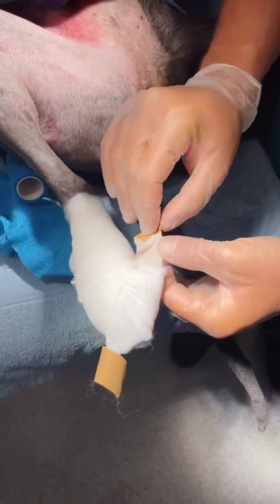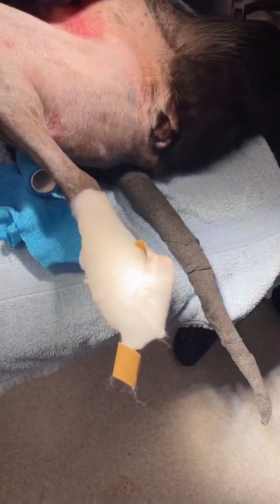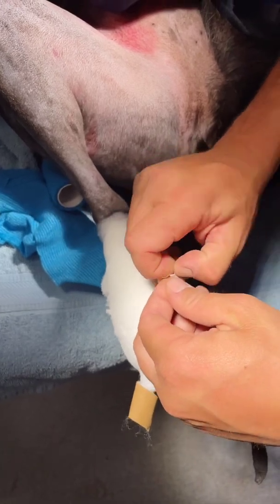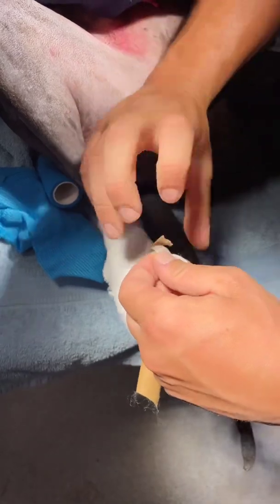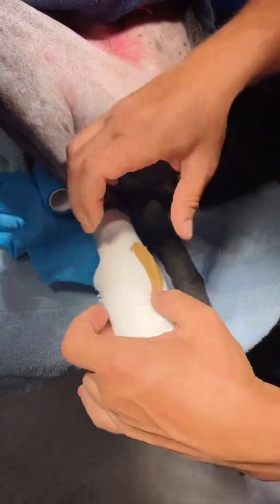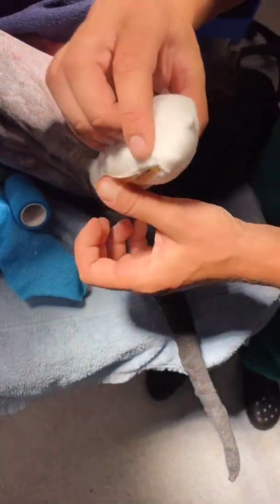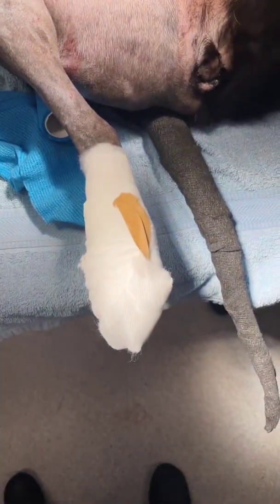I'm actually gonna take my gloves off to do this because it'll be impossible with gloves on. Our wound's covered, so we don't need to stress too much about contaminating it at this point. I'm gonna unfold my stirrup like that, twist that around, and fold that back on itself. We're gonna do the same thing on the other side — twist that around and come back there. You can see now it's got a nice bit of padding under the foot.